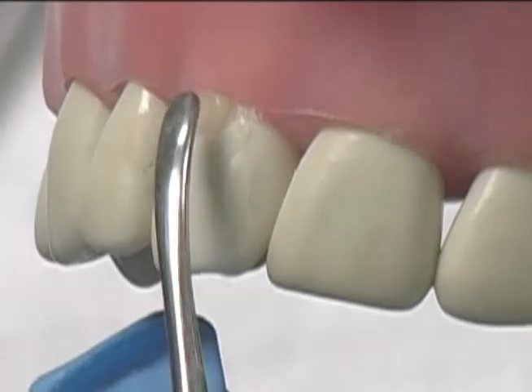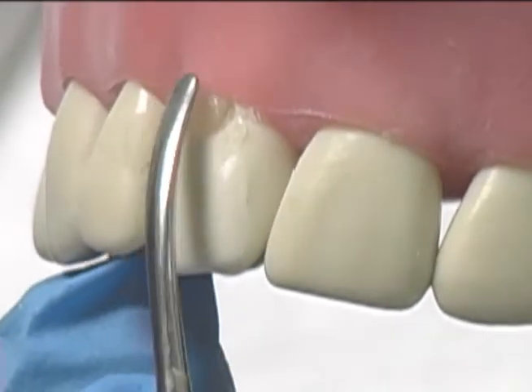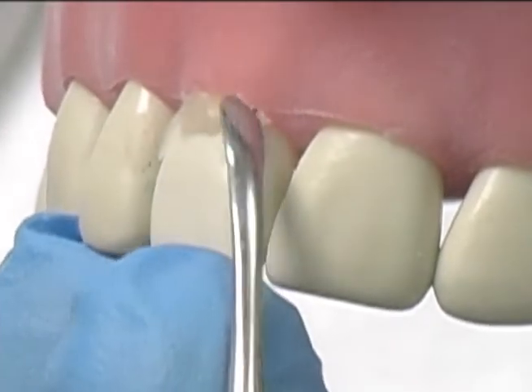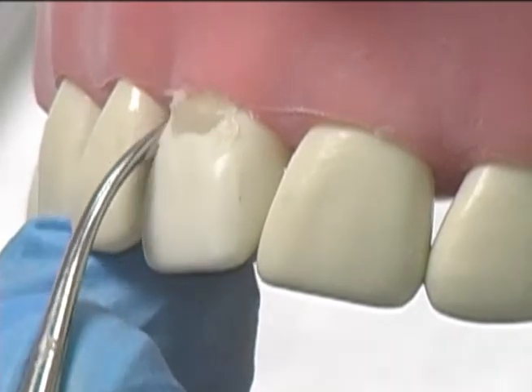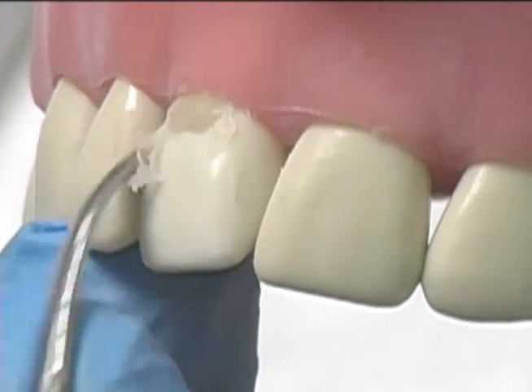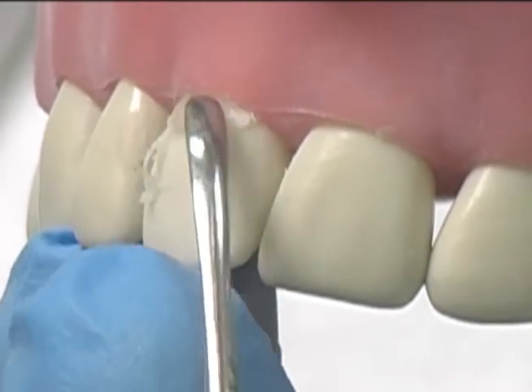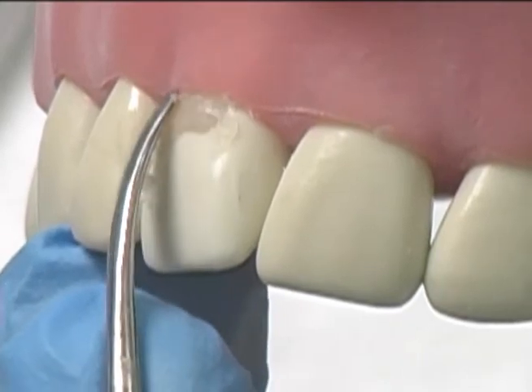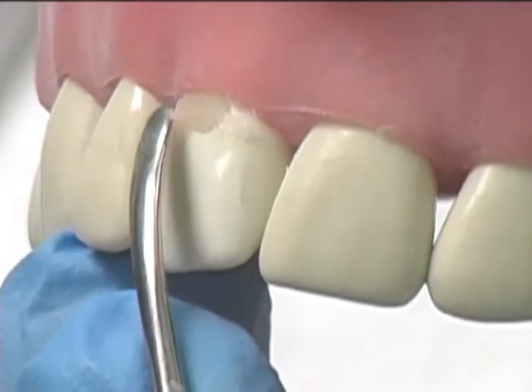I'm using a beaver tail and the curved portion of the beaver tail to help to conform to the convex surface, moving the composite from the center portion to the outside portions of the preparation. This would be a good point at which to add some composite resin monomer to allow the instrument to release and to develop a smooth contour.